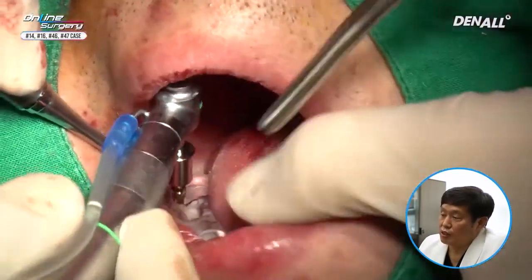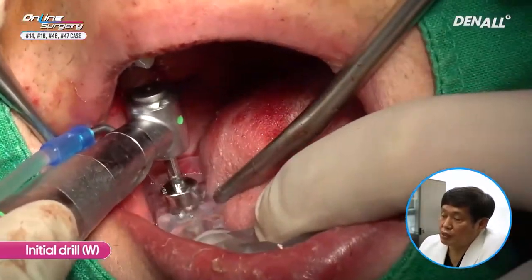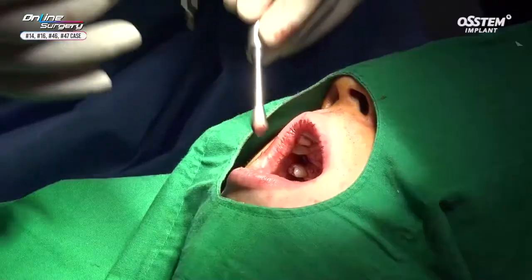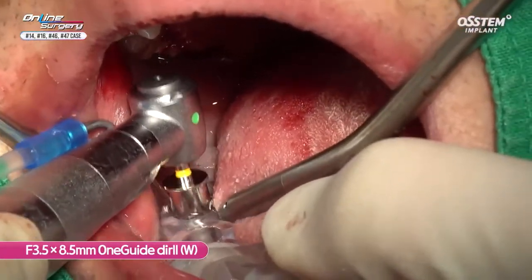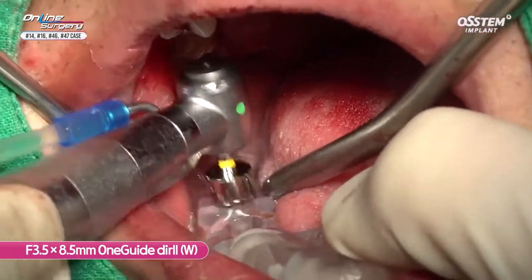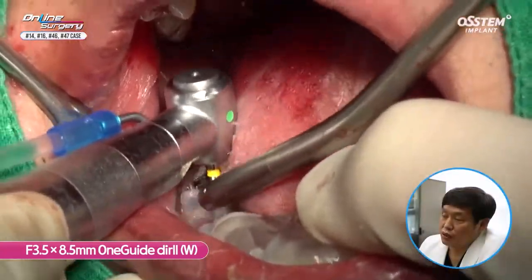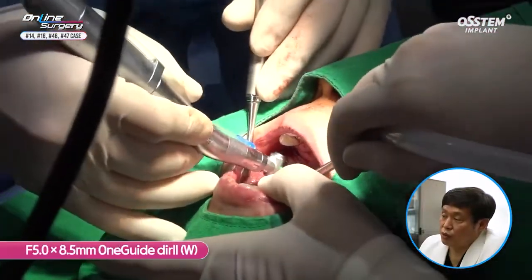The initial drill in number 47 is being done. 5.0 by 8.5 OneGuide drill is used.